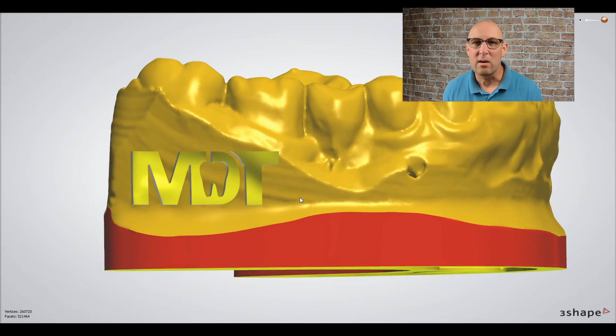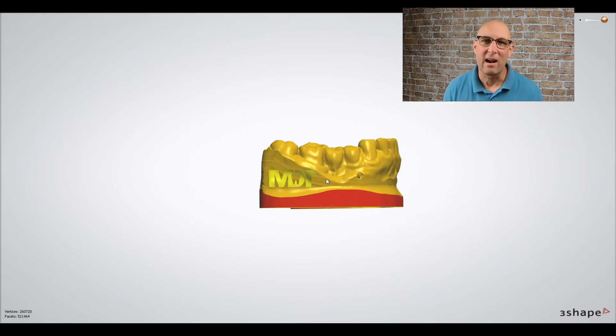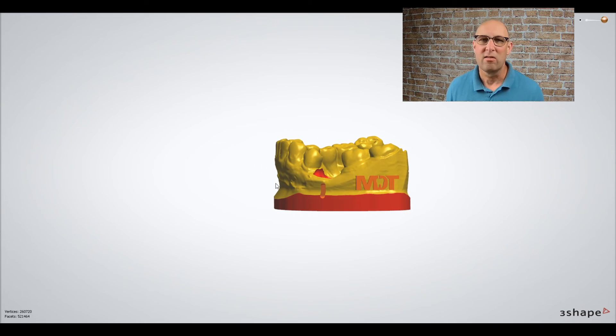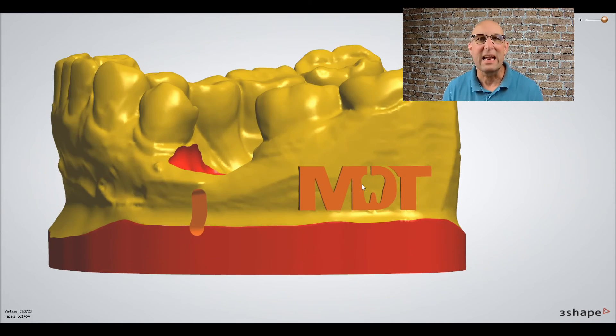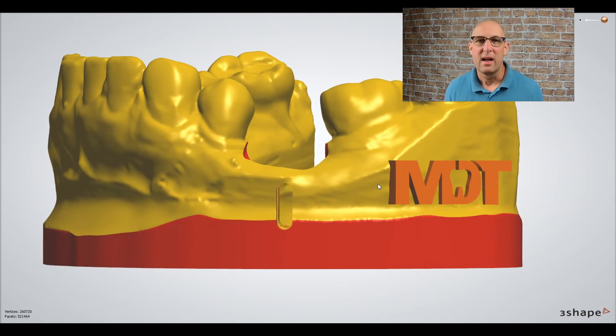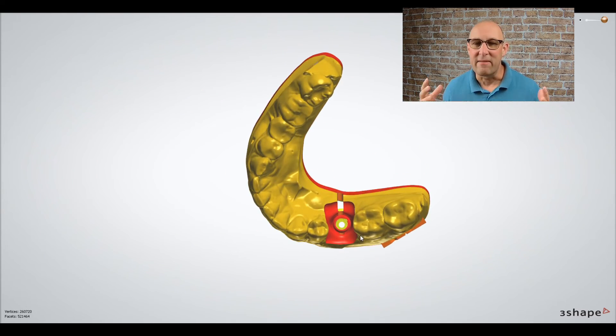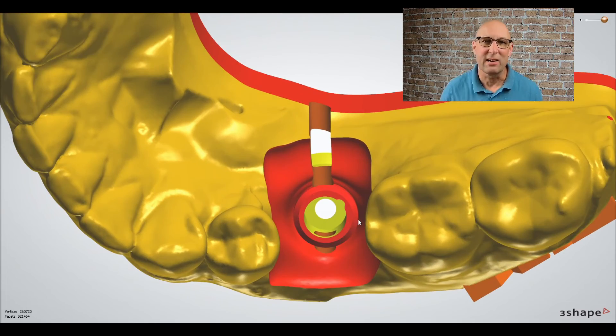Then you can print the model. You have to put the analog into the space — in some cases you have to push it in with some force, but that usually works really well. That was really it; it's not difficult at all. It's a very simple workflow and you can do it too.